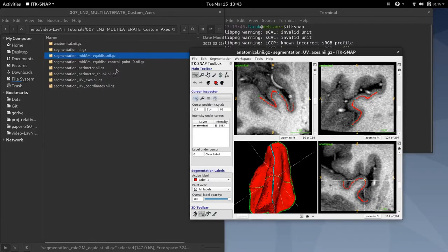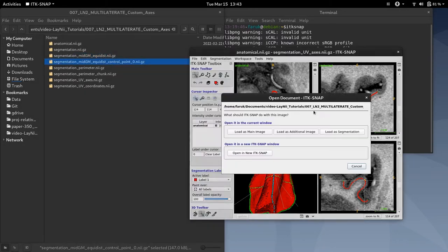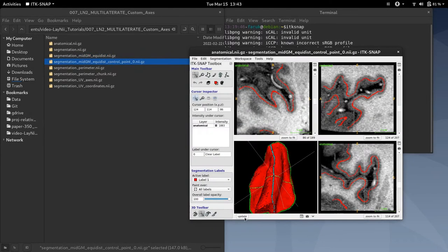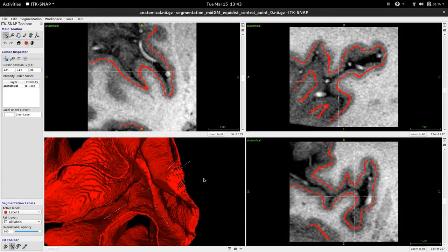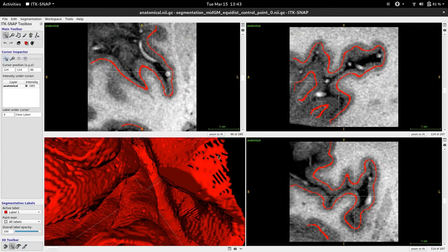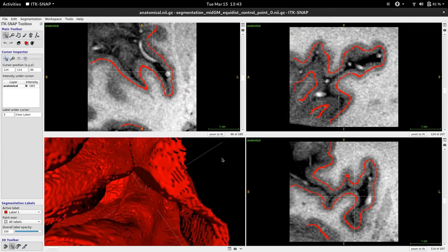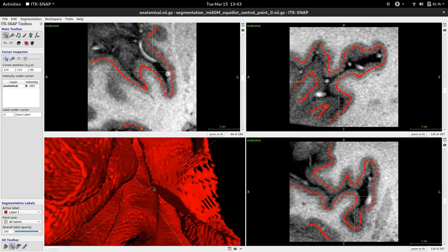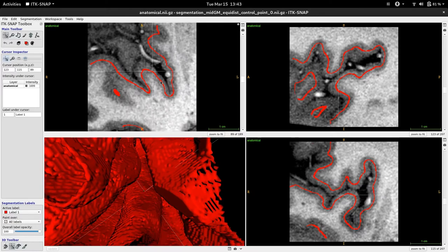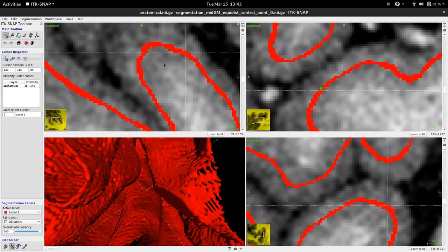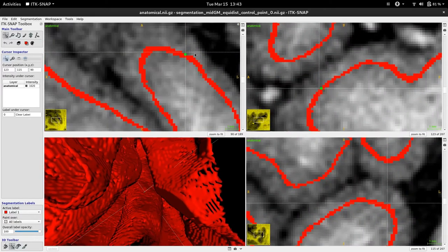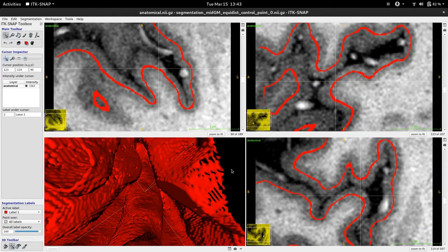So now, let's go back and load our control point 0 file. Here, you can see that we have a control point that is just the center of the disk that we are going to flatten — should be around here. To demonstrate ln2_multilaterate's custom axis function, I would like to show you how to edit this file.